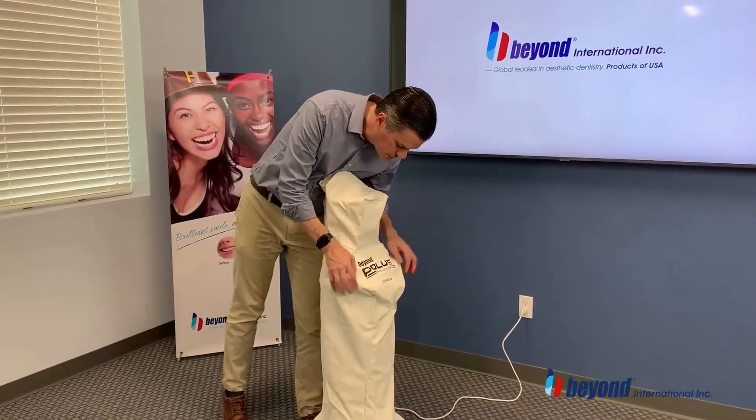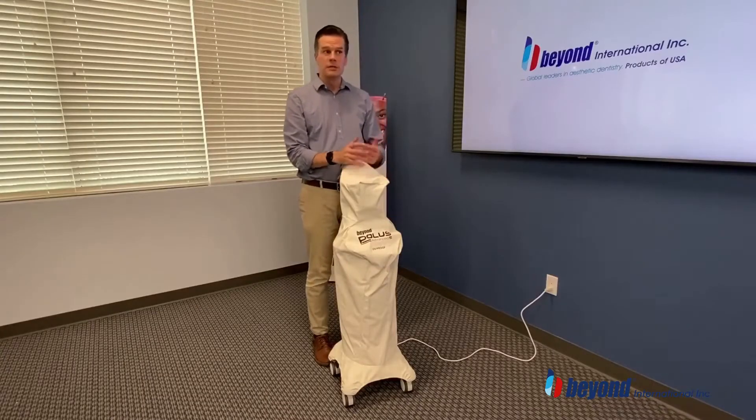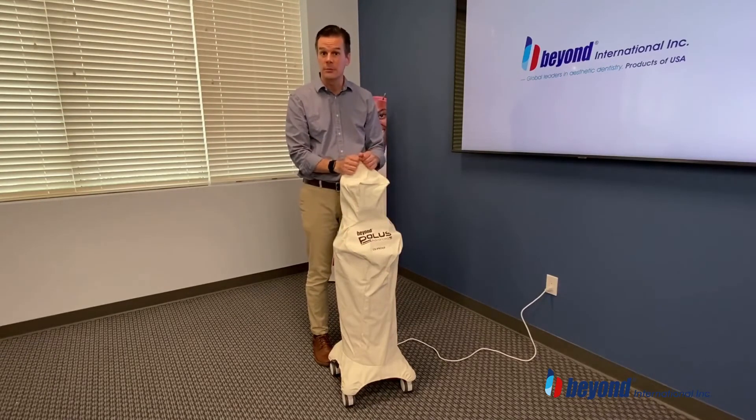You will notice on the front of this unit it says UV proof. The purpose of this cover is that some dental offices may use UV light for their sanitation procedures. In a situation like that, this cover will protect the unit itself from UV light and keep it from degrading.